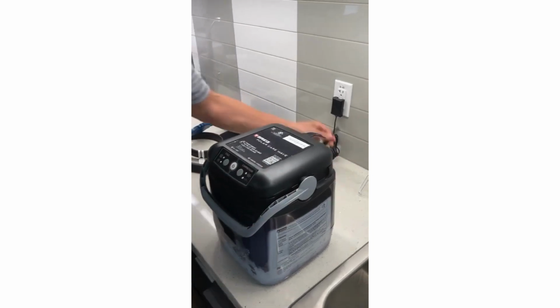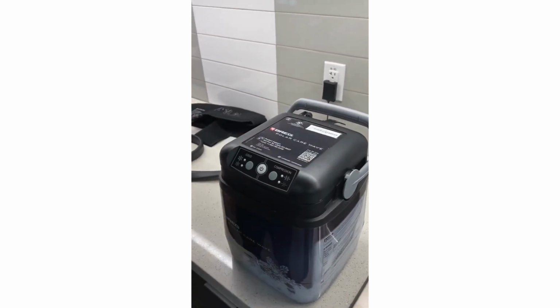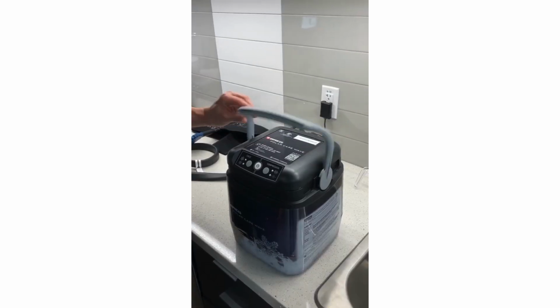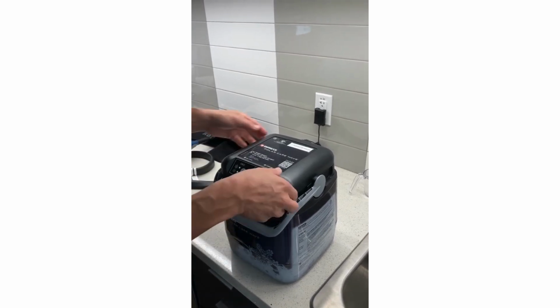Put the lid on the unit and insert the cord into the lid connector. Run the cold therapy for 10 minutes on the coldest setting. After 10 minutes, stop the unit, unlock the lid, and then push the power button and unplug from the lid. Remove the lid from the unit.